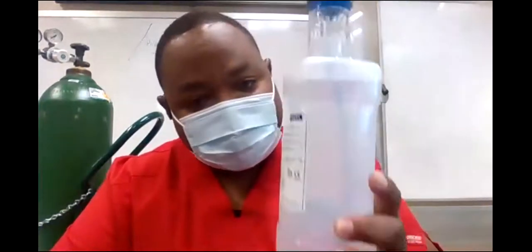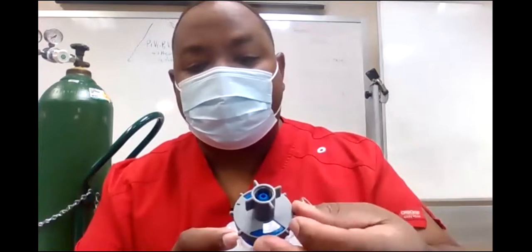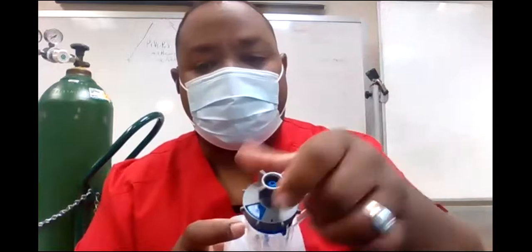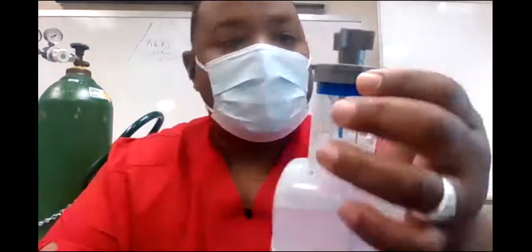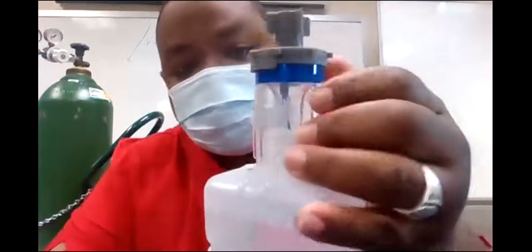The aerosol setups are also high flow devices that use the same Venturi system, except it encompasses water. So not only is it the Venturi system, see the windows up here? See how I close that window, or I open that window? Close the window, see it's closed. Or I can open it up. Air entrainment or no air entrainment. Notice how it corresponds with the numbers. So it's totally closed, the windows are closed at the top. Now what's the FiO2 say?